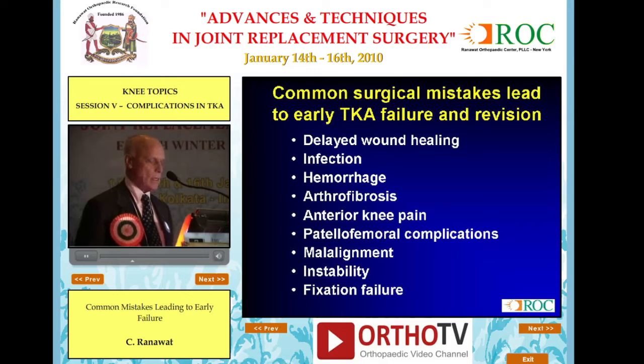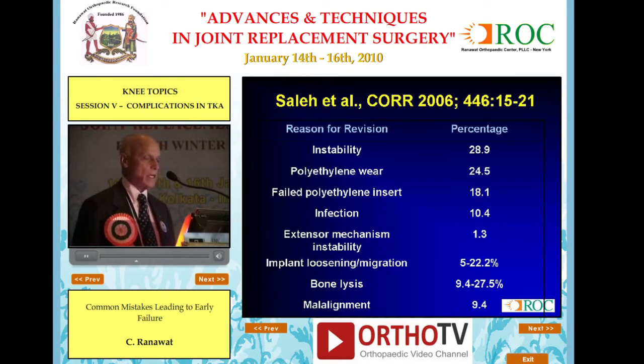Anterior knee pain, which occurs due to certain design and oversizing of the femoral component. Patellofemoral complications, a topic in itself: malalignment, instability, and improper fixation due to poor cement technique.